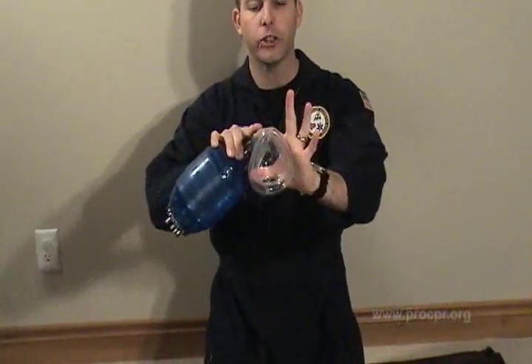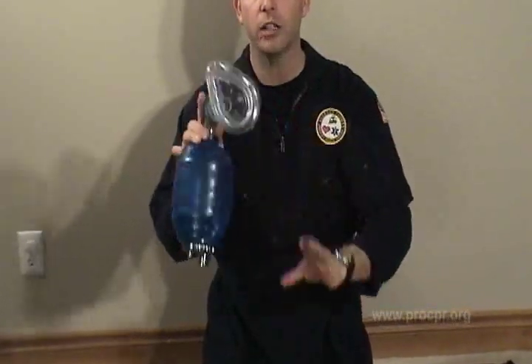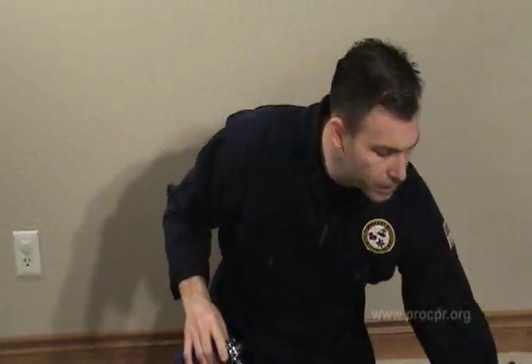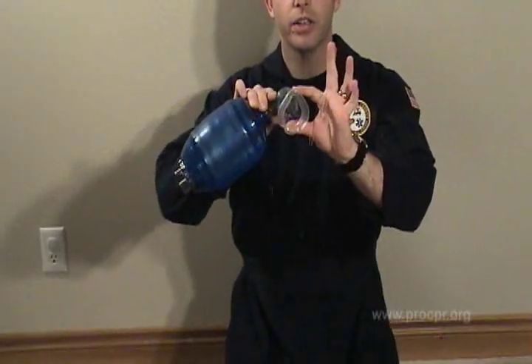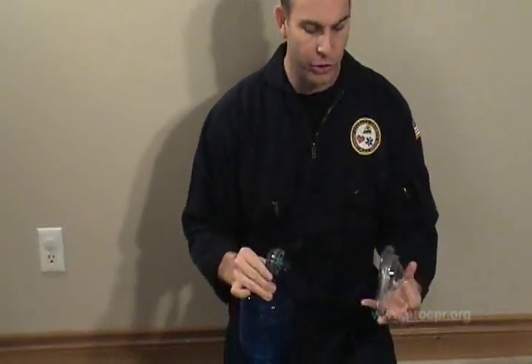We're going to simply attach the bag valve mask to the face shield for an adult and for a child. We'll take the large one. If it's an infant or a pediatric child, it's going to receive this size bag or this size mask. And it's important to get the right size mask with the right size patient.